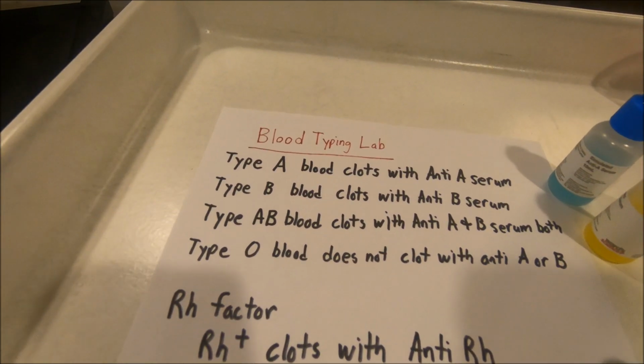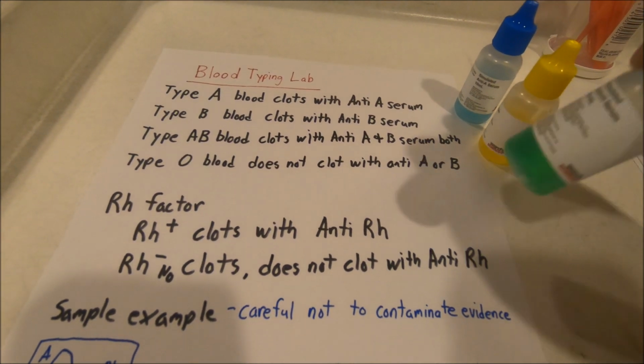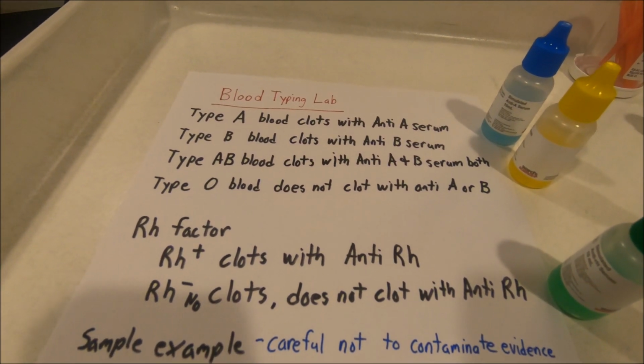The other factor we're going to be looking into is the RH factor. If the blood clots with the RH factor, then we have RH positive, or just positive. If it does not clot with the RH factor, we have negative.